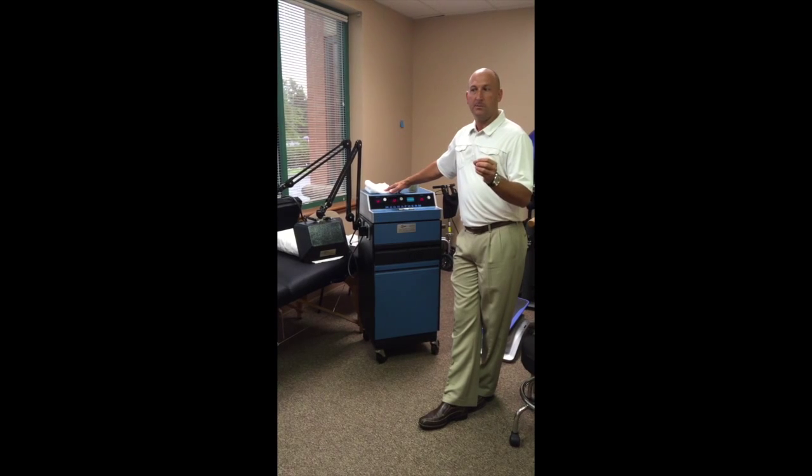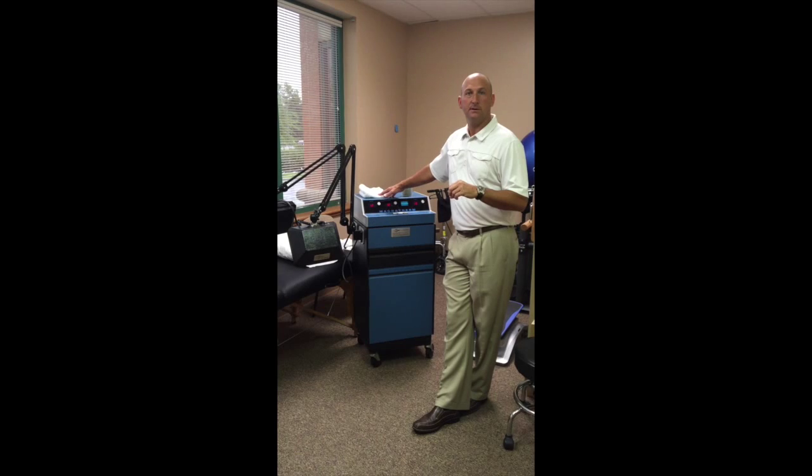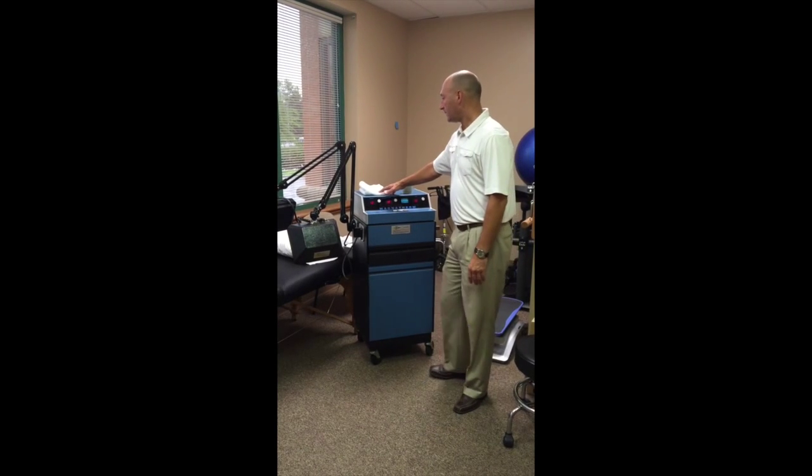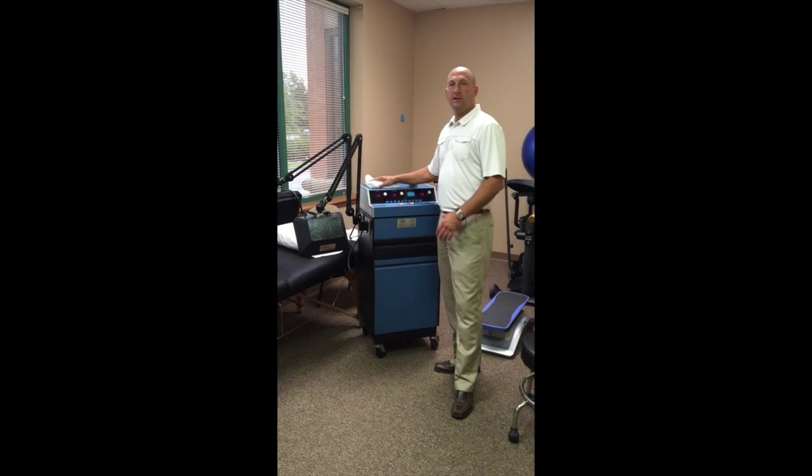Shortwave falls under the electromagnetic form of energy, which is one of the forms of energy that you guys will find in, I believe it's your 2.2 or 1.2 outline.